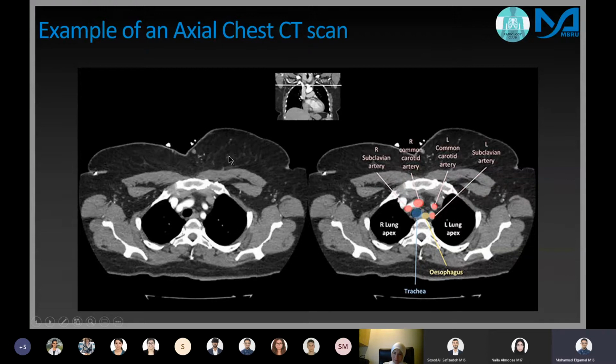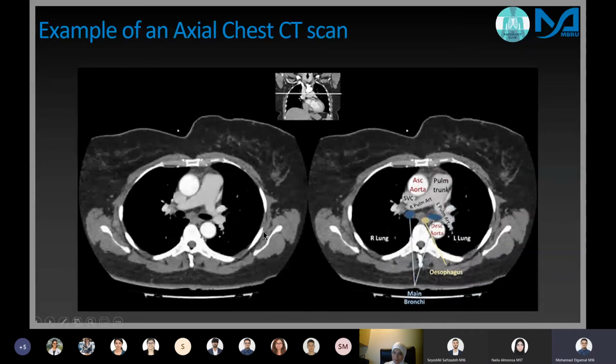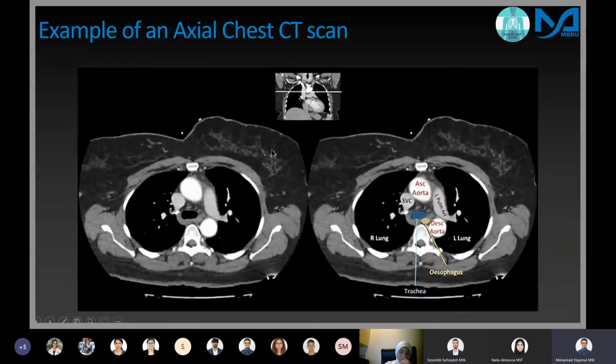What window are we using? I told you it's the most common window, so if you picked that up, you'd be able to tell. And you can obviously look at the tissue themselves. Exactly, this is a soft tissue window. So you can see the soft tissue is very clear. If I scroll down, we'll be able to see the tissues in the heart, the muscles in the back, the breast tissue in the front, all the fat and so forth.